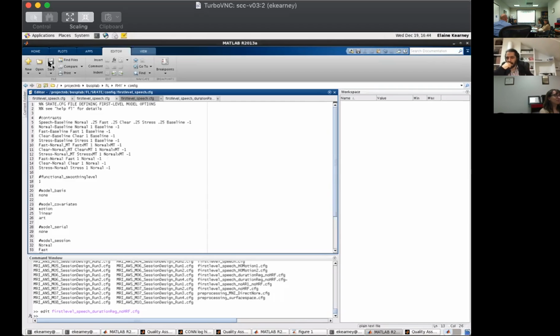Actually write some sentences that say, this is the thing that I want removed or accounted for or controlled for, and this is the reason. Generally, when thinking about control variables, there are two things you need to check to see whether it's a problematic variable. One is, does it affect your measure of interest? In this case, it's something that potentially affects the BOLD signal. Is this particular variable something for which I can justify a mechanistic way in which it affects the BOLD signal?